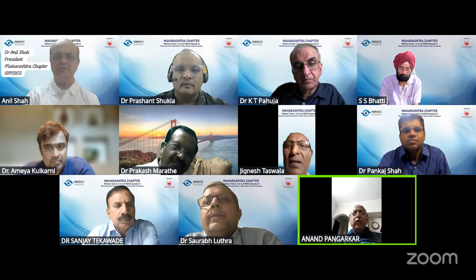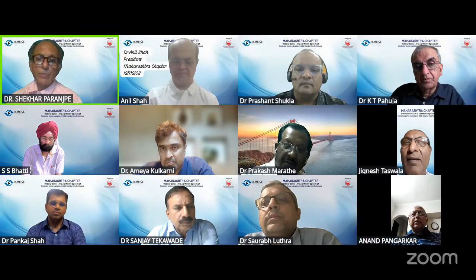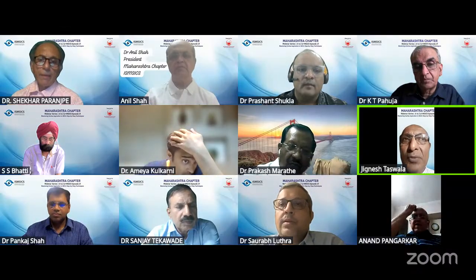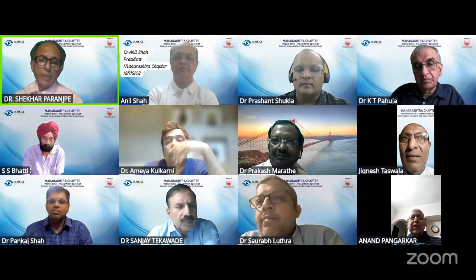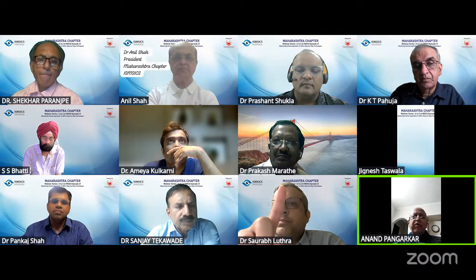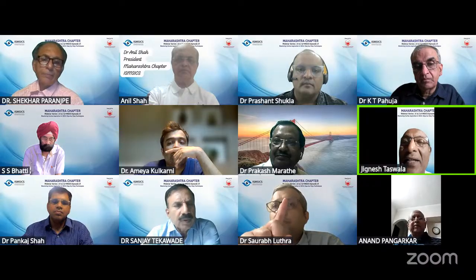Definitely a good one. Now you see, there must be very personalized studies because not more than 10 surgeons must be using it. So my personal experience is definitely in favor of that. But after using that, you have less PCO? Yes, less than 1%, I would dare to say. Otherwise, you need to just have 50 cases in which UV light was used and 50 non-UV and find out the PCO rate. Absolutely. That will give a good idea exactly how well it is working.